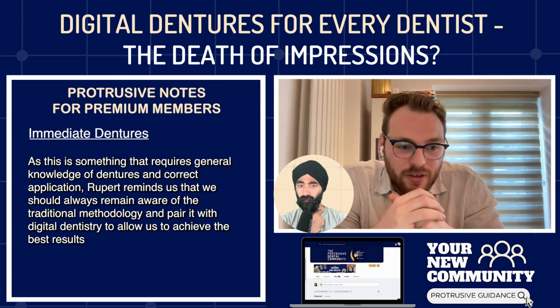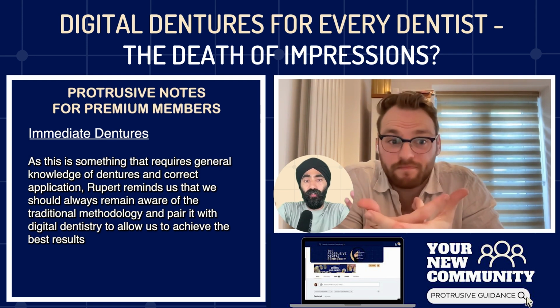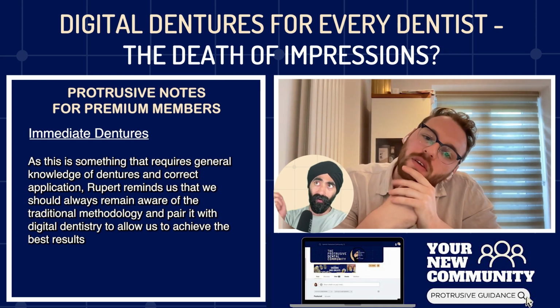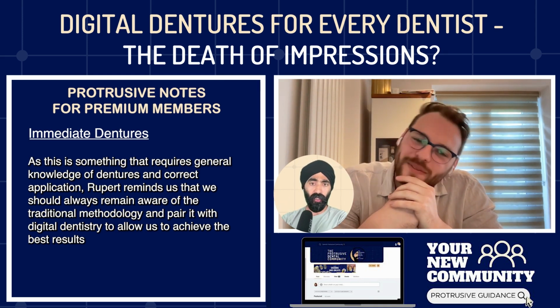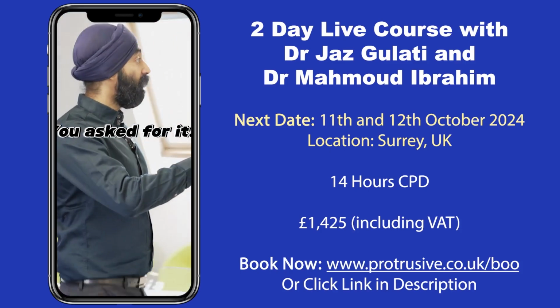I just get regular silicones and just pop it in, which is good because everyone listening to this who doesn't have PIP, they've got silicones they can use, right? So that's the good thing you mentioned there, because we've all got it in our drawers. We can use that. Now, you've said about finding out where it's overextended. What about if it's underextended somewhere? We can just get our chairside acrylic and just add some, and then do the border molding chairside, right?